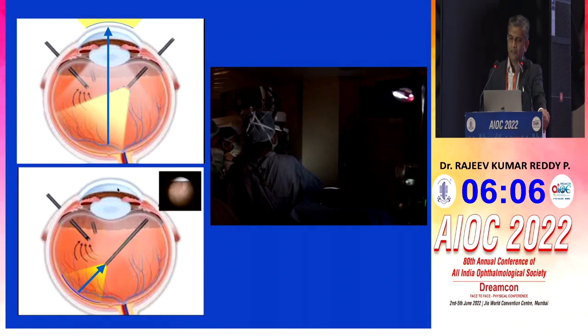And then when you are doing surgery, this is a surgeon and this is the monitor which is there here, where you are able to see the image and do a surgery using that. So the disadvantage of doing this is you have to look at the monitor and do a surgery, and it's a two-dimensional image. Like you said, that you are getting only one camera. And the illumination of this varies sometimes.